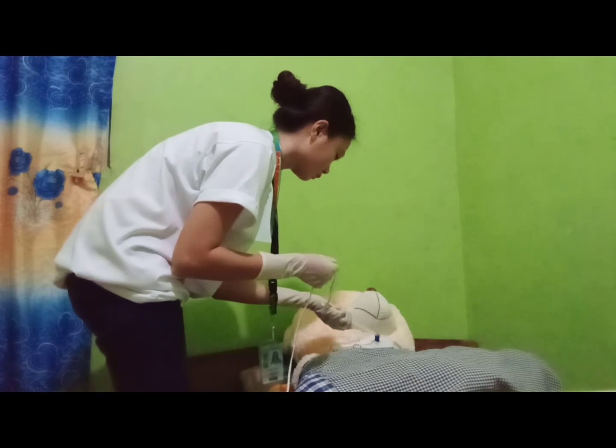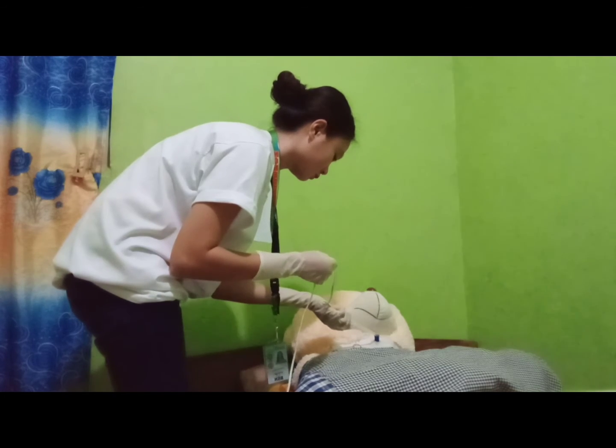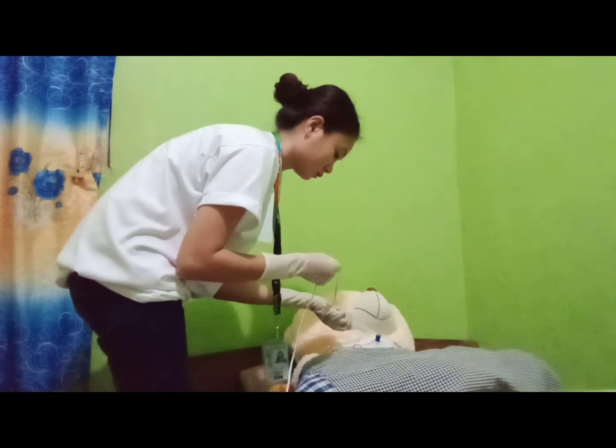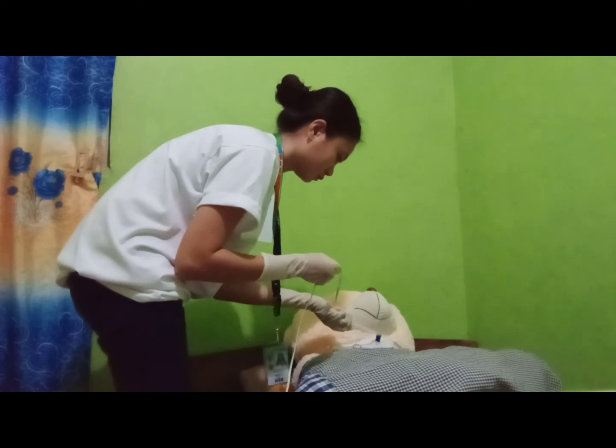Without applying suction, insert the catheter gently along one side of the mouth, advance to the oropharynx. Apply suction for 5 to 10 seconds as you rotate and withdraw catheter. Allow 1 to 2 minutes between passes for the client to ventilate.